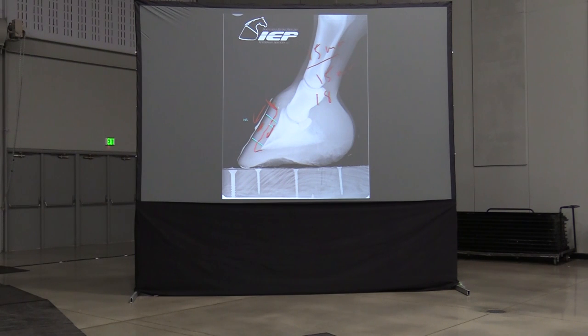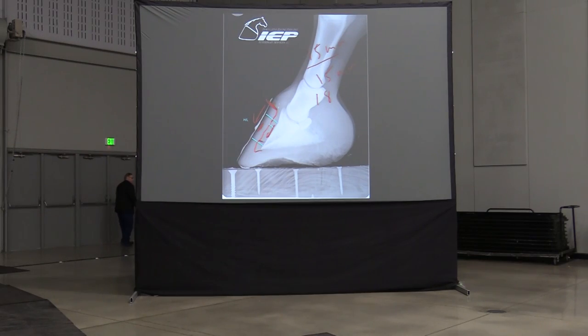And if I'm dealing with cases that have structural failure of the lamina already, you'll see that instead of measuring just the rotation, I'll actually measure the lamellar zone top and bottom. And then obviously if they've rotated, you're gonna have a diverging or a wider lamellar zone at the bottom than you do at the top. And I'll record those numbers in an effort to follow that case.